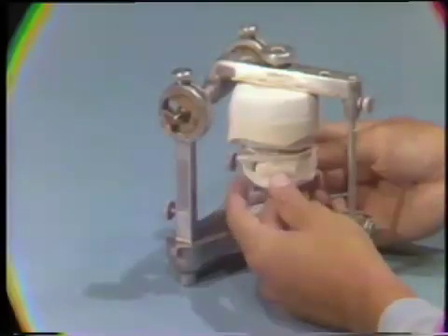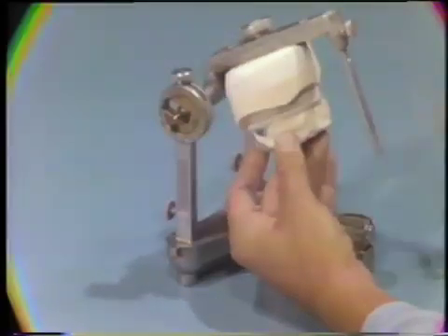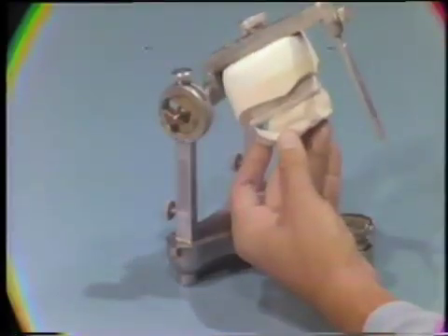Next, place and fully seat the mounting guide on the maxillary cast, and secure with sticky wax.